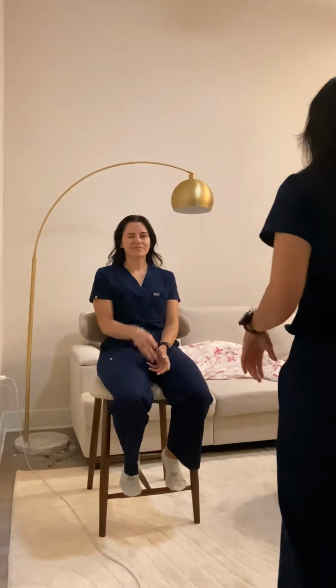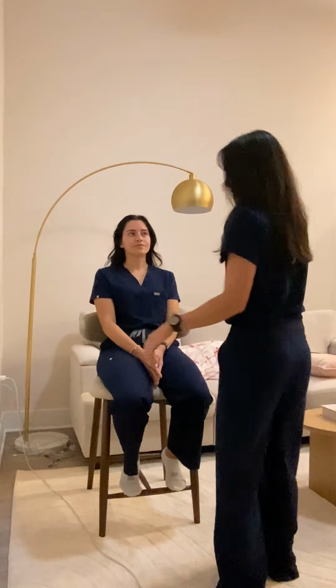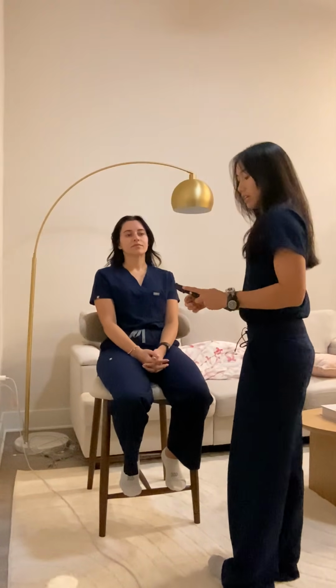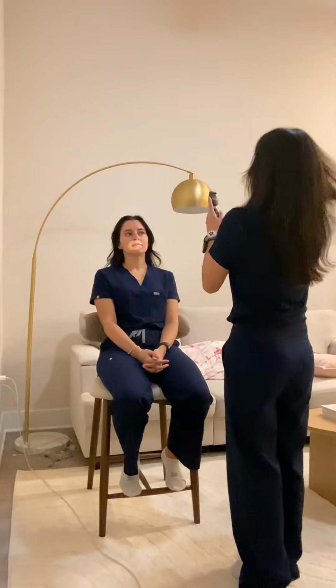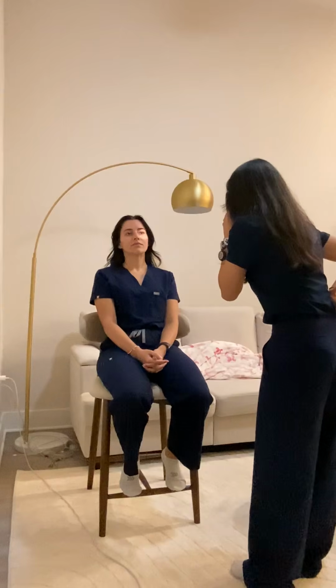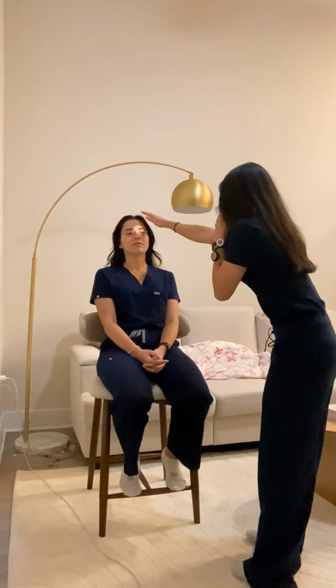Next, I will move 15 inches from my patient and 15 degrees from the midline. And I'm going to assess the red light reflex. I'm going to start my finger on 0 and keep it on the diaphragm. I see the red light reflex. Then I'm going to come closer.